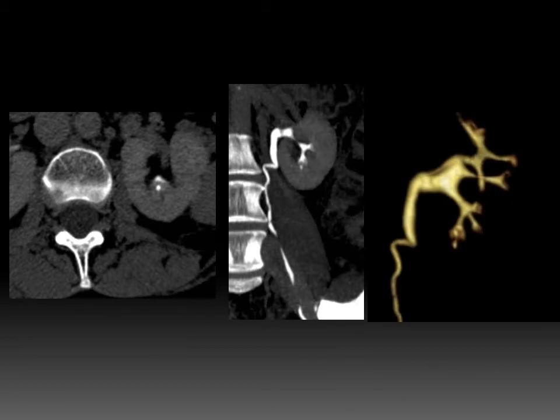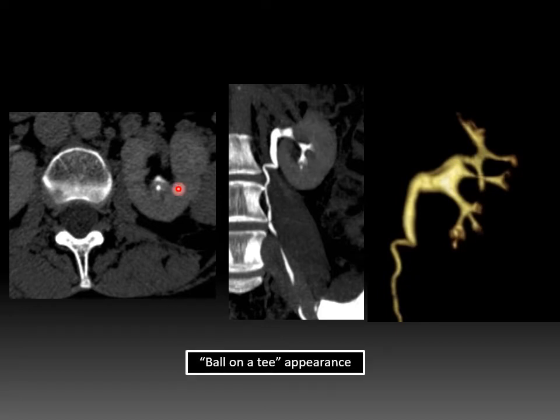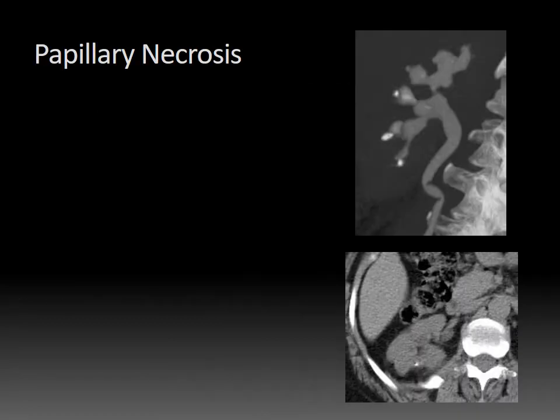Here is a different case of papillary necrosis involving a single pyramid. You can see it has that ball and a T appearance — upside down, but it still applies. The tip of the medullary pyramid has become ischemic and filled with contrast as it left a void. You can see it again on the coronal MIP image and on the 3D volume-rendered reformat. This is a different case of multifocal papillary necrosis, showing the multifocal ball and a T appearance on the coronal MIP excretory phase image. On the non-contrast image, you can identify extensive renal parenchymal scarring, which often coexists with severe papillary necrosis.